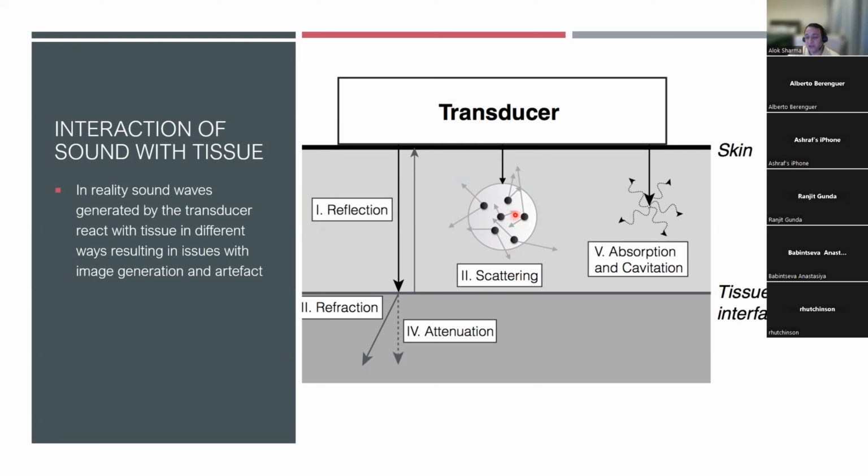So if you have an extravasation in the liver with something that has calcium in it, that'll be bright, and that'll interact in a bright way, and you'll get an echo bright area in the liver. On the other hand, if the tissue is uniform and pretty much nothing bright is there to reflect back, you can get, I would say, a hypoechoic appearance to the liver, but you can see its texture because of this concept which we call scattering.